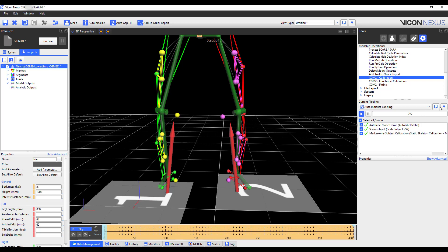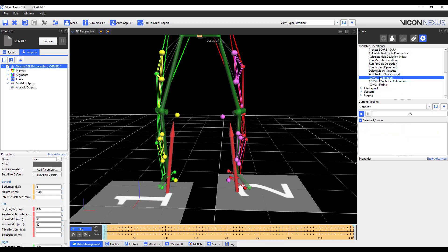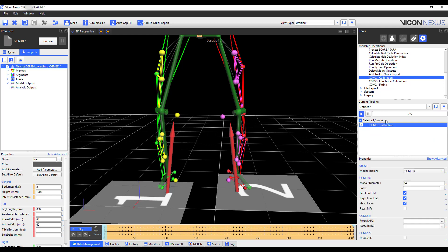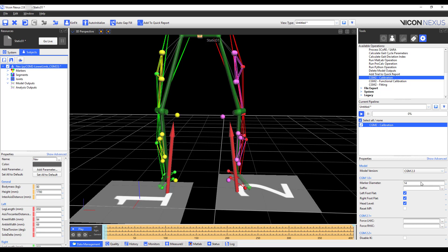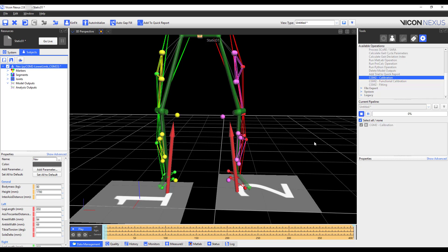When time to run the model, I'll create a new pipeline. I'll add in CGM2 calibration. I'll specify the correct model, CGM2.3. And I'll keep the parameters as they are, but I'll add in a suffix so that it will appear as underscore py. I'll go ahead and run the pipeline, and just keep in mind that this may take some time.